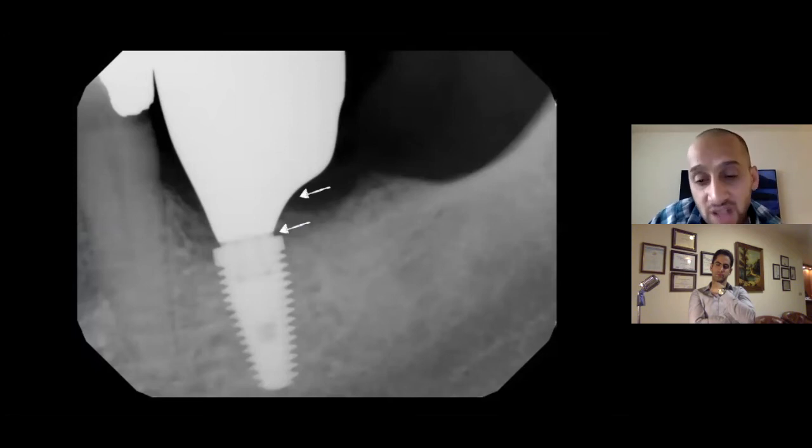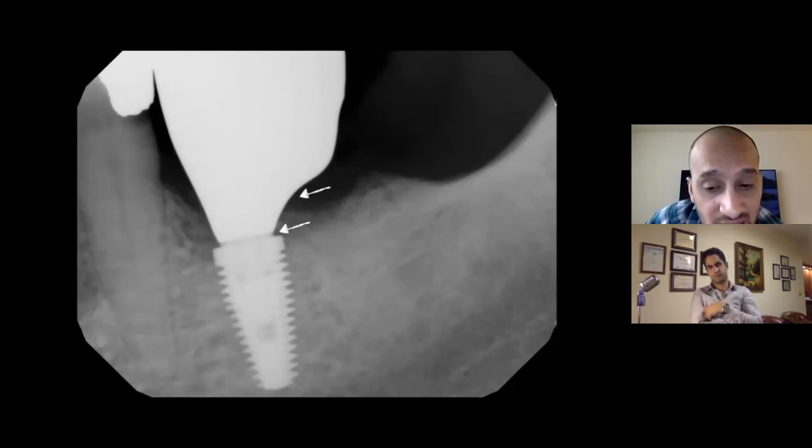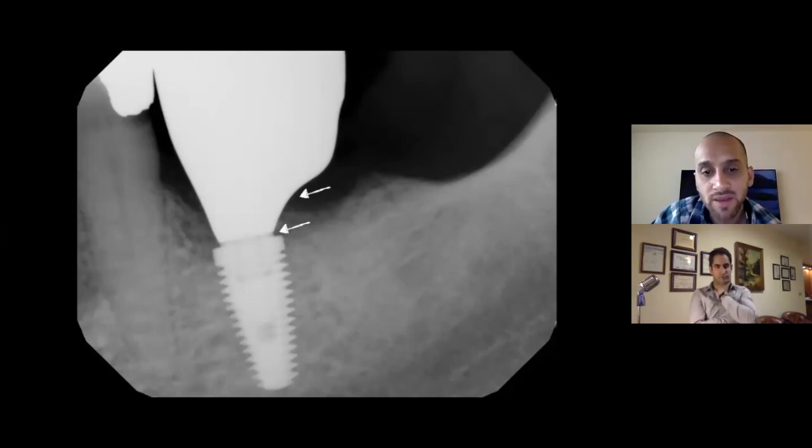That connection is not only clean, that connection has the right soft tissue lining to a polished zirconia. That connection is also very pristine. It has only up to a 2 micron fit, which the passive abutment would provide. It has the least amount of titanium and the most amount of zirconia. So this is how I do my single crowns, which I mentioned earlier.